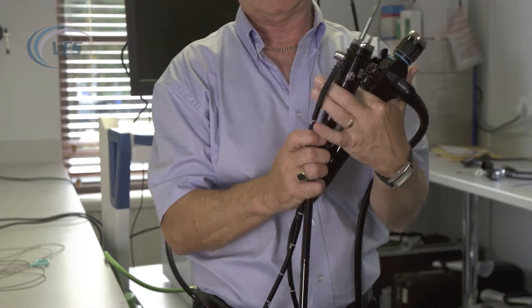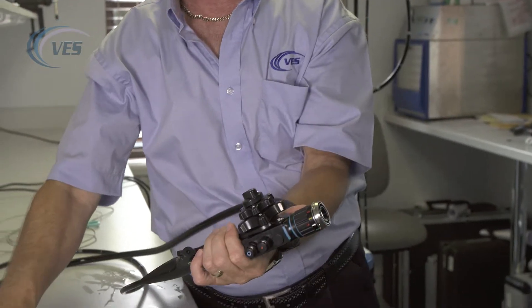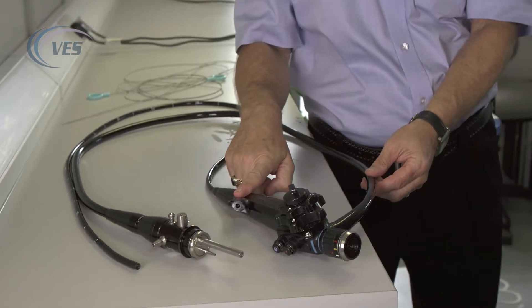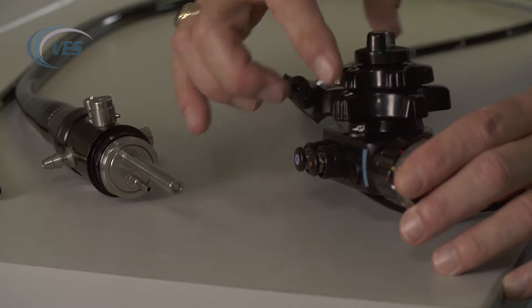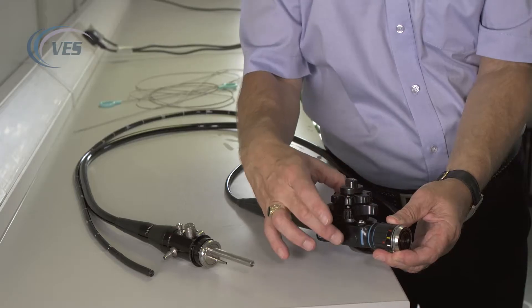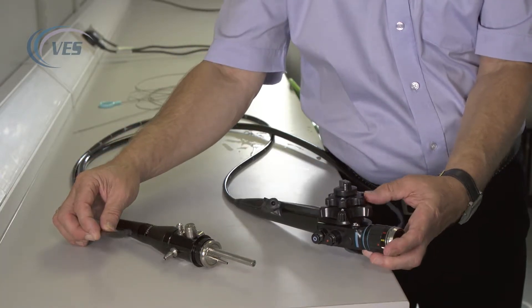What is really important to preserve the life of the scope is to make sure that the distal tip is straight before introducing anything through the biopsy port. To check that the tip is straight, the U and the L on the wheels here are lined up together just behind the red button. As you can see, the tip is now quite straight.